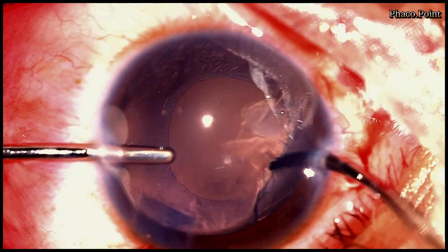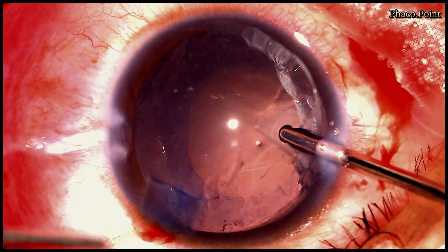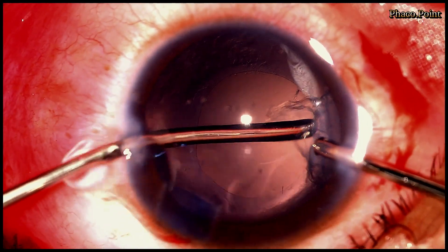I prefer bimanual irrigation aspiration always because I believe it helps with the circumferential removal of the cortex with significant ease.